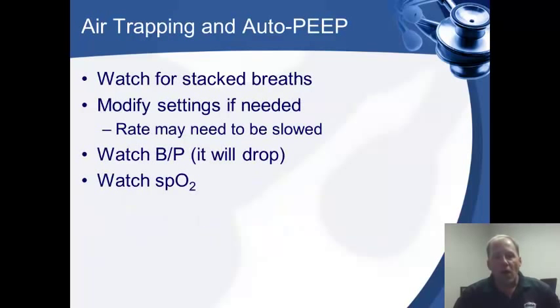All right, air trapping and auto PEEP. You got to watch for stacked breaths. We don't want to keep breathing for the patient if they haven't had time to expire. This increases the intrathoracic pressure, as I mentioned before, and it could drop their blood pressure. You got to watch your SpO2 and make sure that you're not giving them breaths too fast. Your rate is going to probably be about 10, and make sure that IE ratio is increased a little bit. Make sure your patient has time to blow that air out.